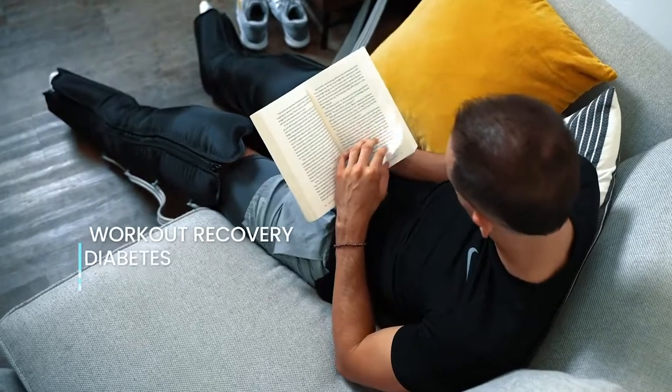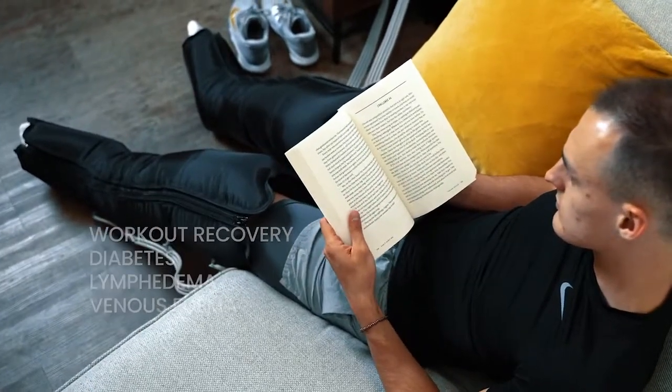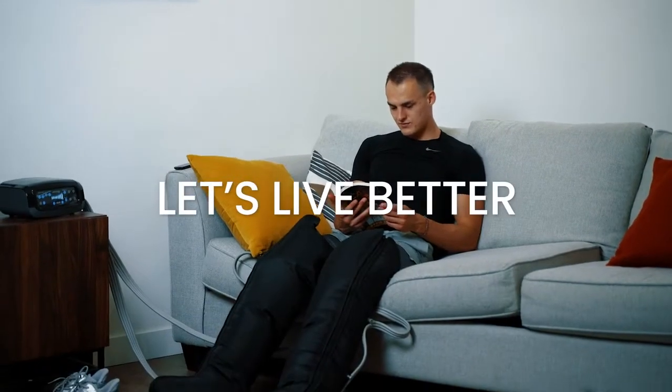The Vive Leg Compression System is ideal for workout recovery, diabetes, lymphedema and venous edema. Say goodbye to pain. Let's live better.